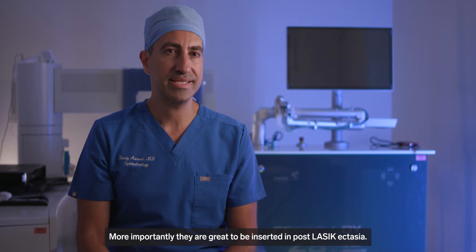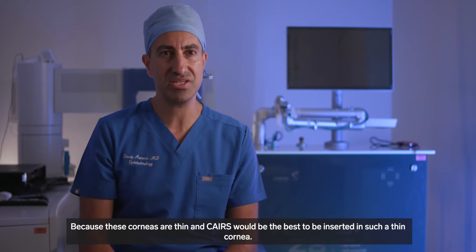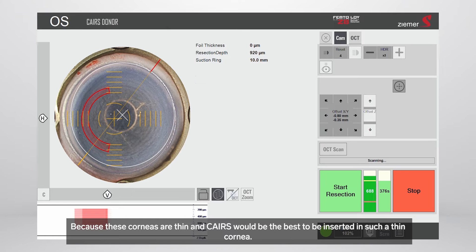More importantly, they are great to be inserted in post-LASIK ectasia, because these corneas are thin and CAIRS would be the best option to be inserted in such thin corneas.